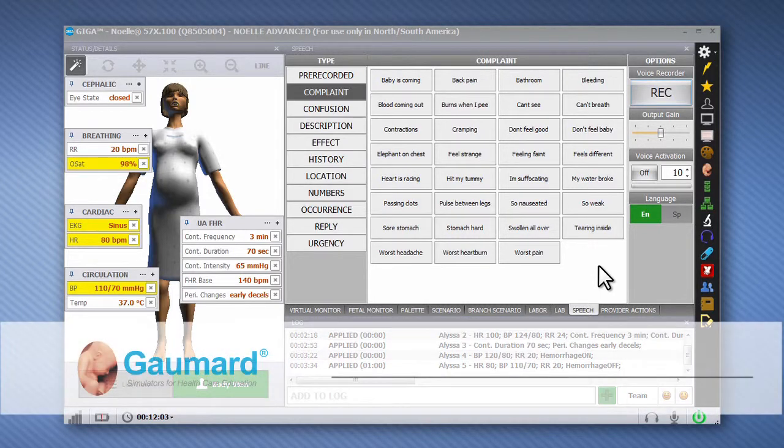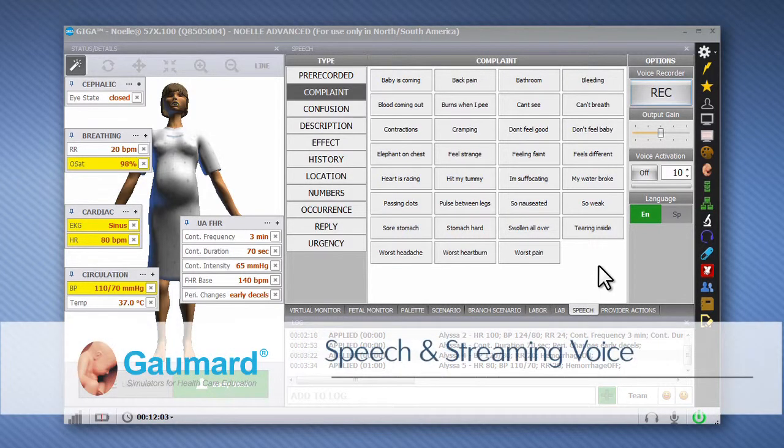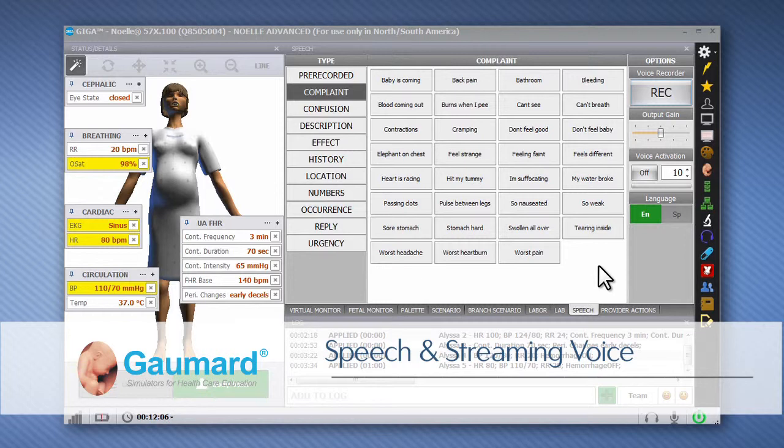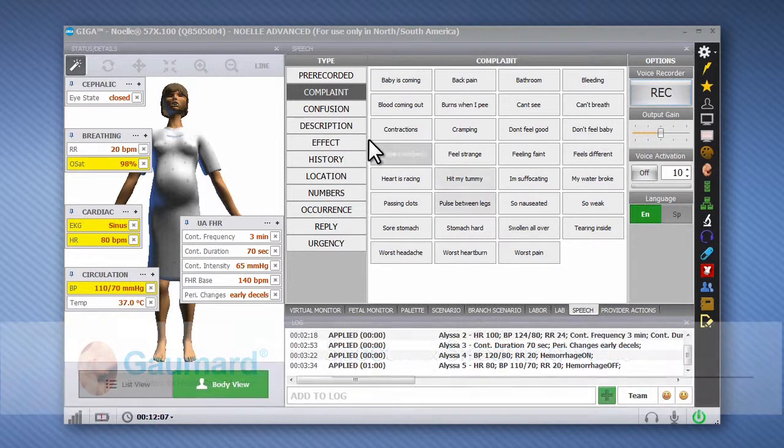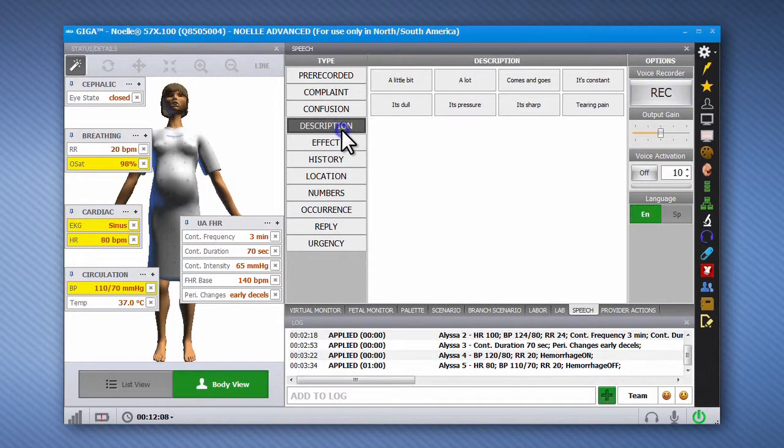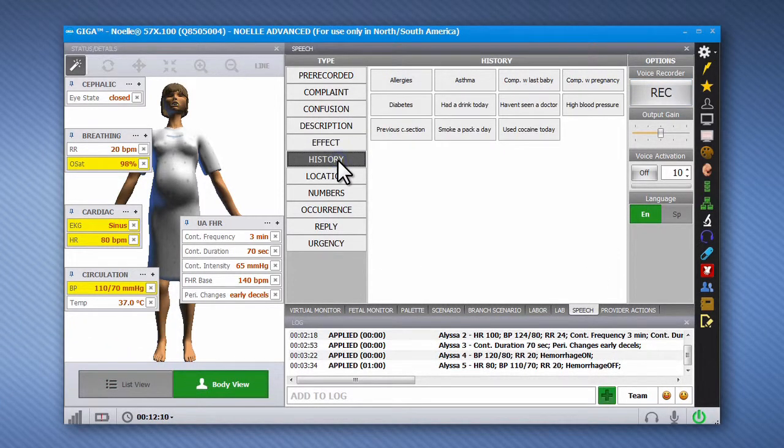Speech and streaming voice. The Speech tab stores a large library of pre-programmed phrases and responses for the simulator to speak.